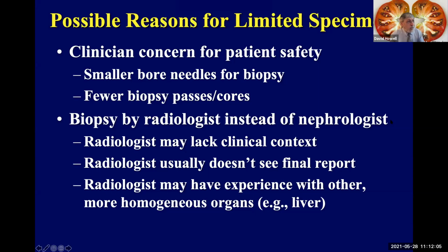And then an important consideration is that over the years, more and more renal biopsies are being done by interventional radiologists rather than nephrologists. And these folks are very skilled at what they do, but they have some handicaps when they're doing a renal biopsy. First of these is they may not have complete clinical context on the patient. They may have been told this patient has proteinuria and we're doing a biopsy to evaluate proteinuria, but they may not know that the patient has chronic kidney disease, which can lead to marked thinning of the cortex, which makes it much easier to punch through with a needle, resulting in an all medulla biopsy.